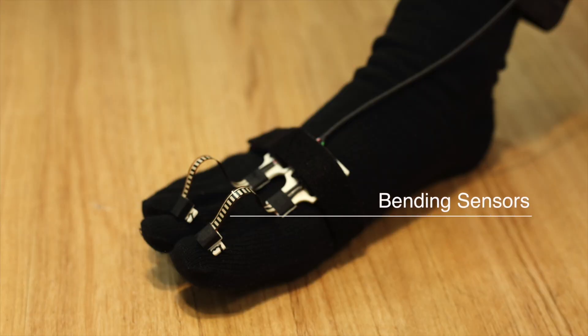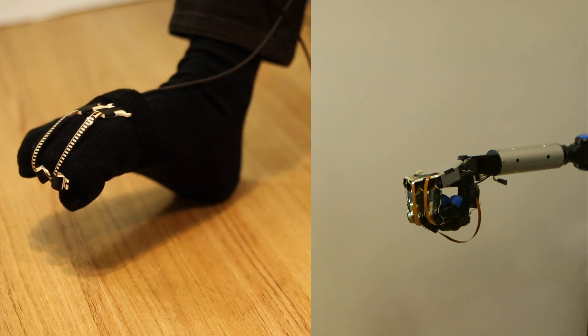A sock device is worn to detect the position of the toes. The sock device includes two bending sensors which measure the movement of the toes and control the condition of the robotic hands.